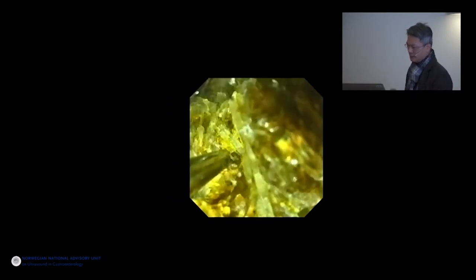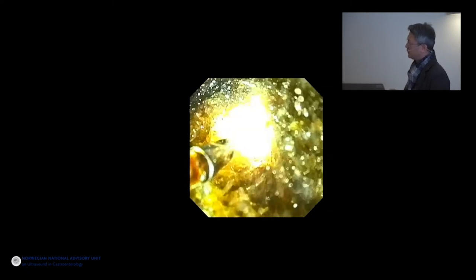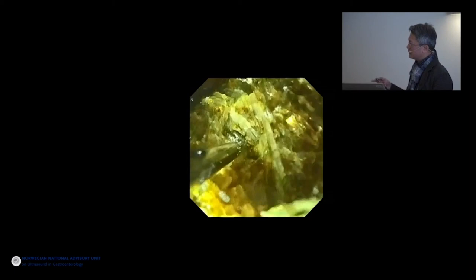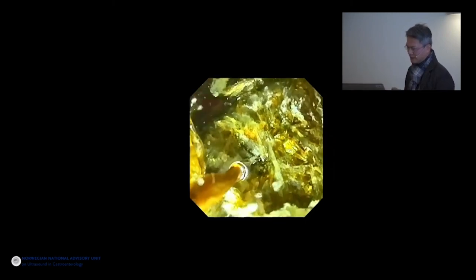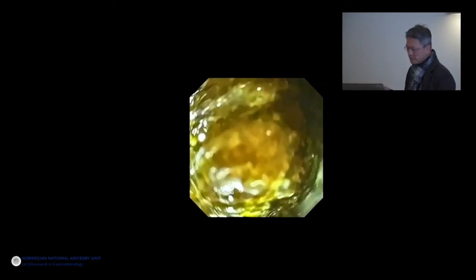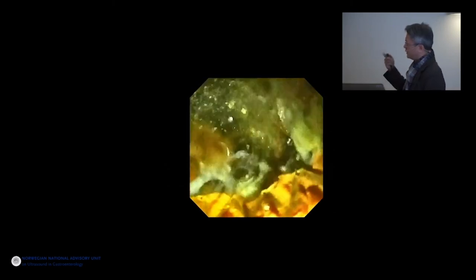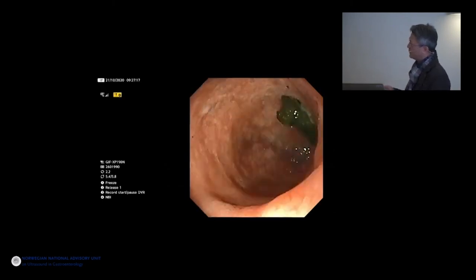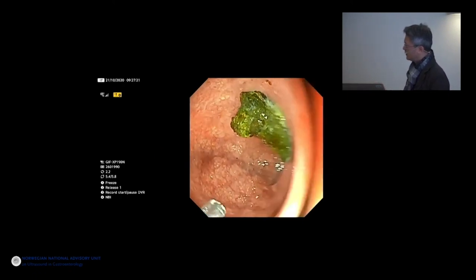And then if you use an ultra-slim endoscope, you can go through the lumen opposing metallic stent into the gallbladder, and then we found in this case huge gallstones, more than 3 centimeters, in which we used electrohydraulic lithotripsy to break down, to fragmentize. In 3 sessions, before we could go inside the gallbladder and see that it's clean. And this is the opening of the cystic duct.